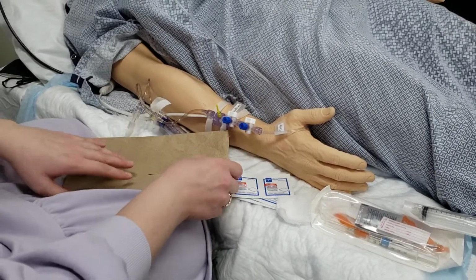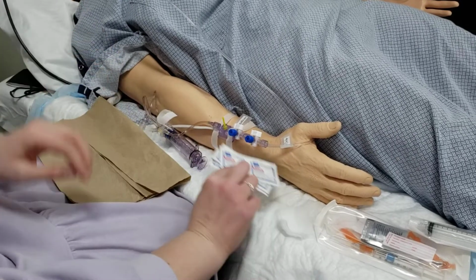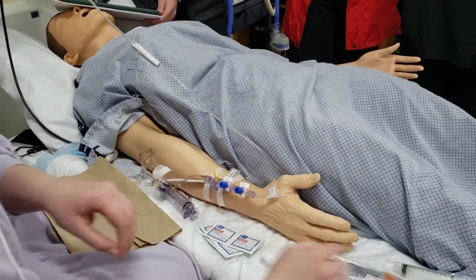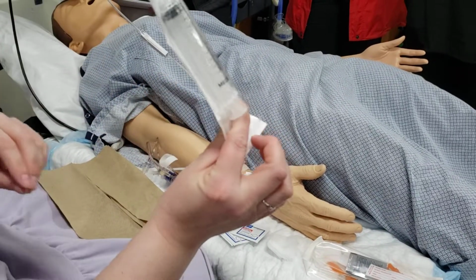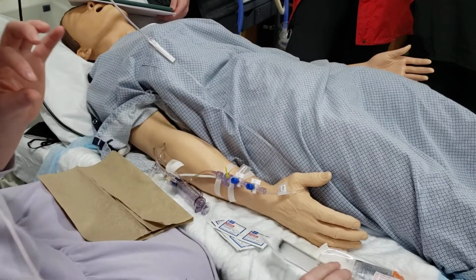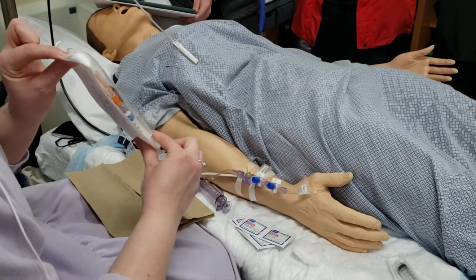A few of the supplies we're going to need. I like paper towels. This is just a personal preference. Alcohol. 2x2 gauze, a normal just sterile syringe. I like 10 ml because it gives me a little more volume. And then an arterial blood gas kit.